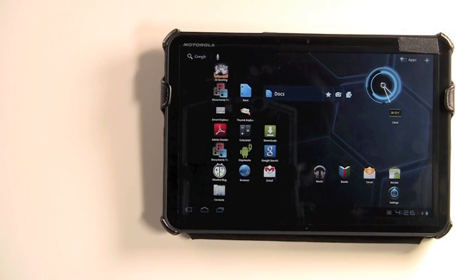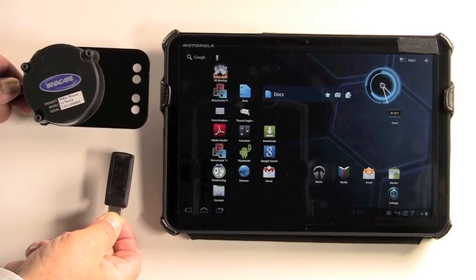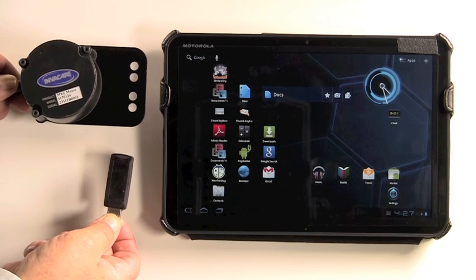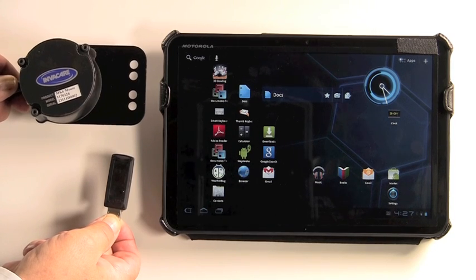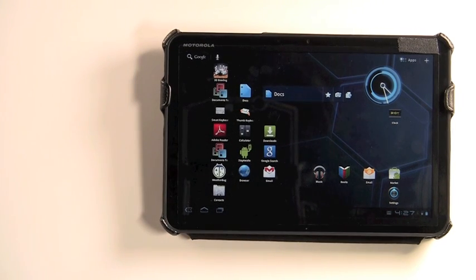In an earlier video, we showed how to use and program the Invacare radio frequency or RF mouse to allow wireless access to a computer by allowing the driver control to emulate or act as a computer mouse. As technology has advanced, so have the requests from our customers. To ensure access to technology when needed, our customers have asked for wireless access to a small portable PC tablet through the driver control, one that can be mounted onto the power chair for the driver to have access to at all times. Recent software improvements have made this possible.